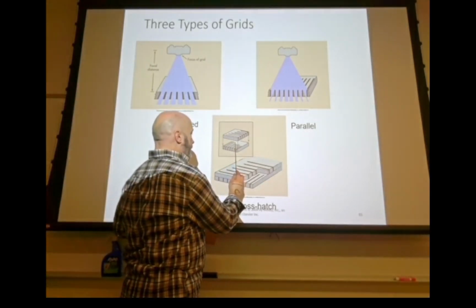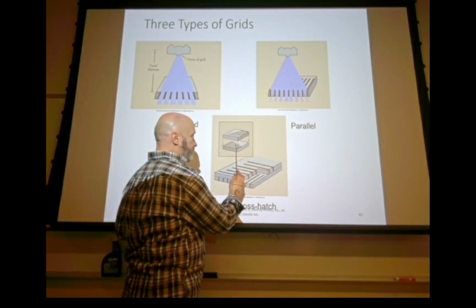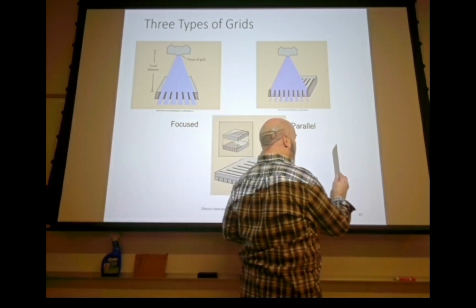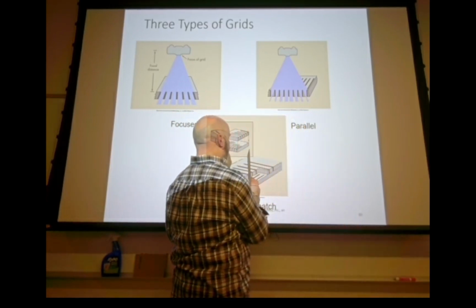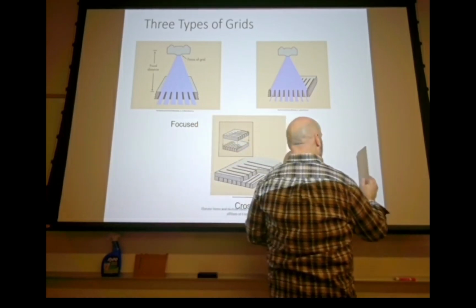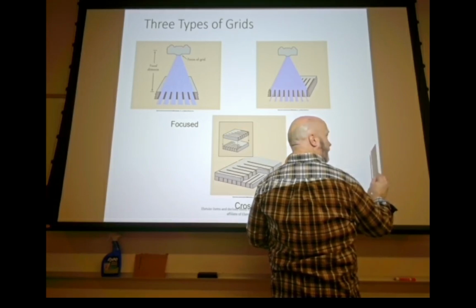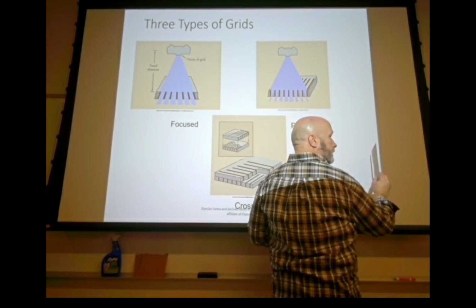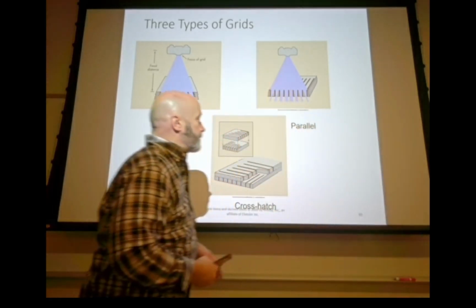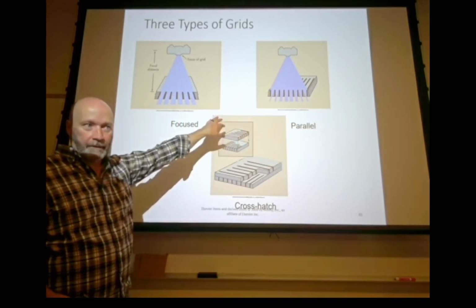So that the lead strips are very vertical for the smallest footprint, but as we move outward, and that footprint would increase, the grid strips are tilted towards the X-ray tube. Okay? So this light, the center of the light is the most perpendicular portion of the light, right?